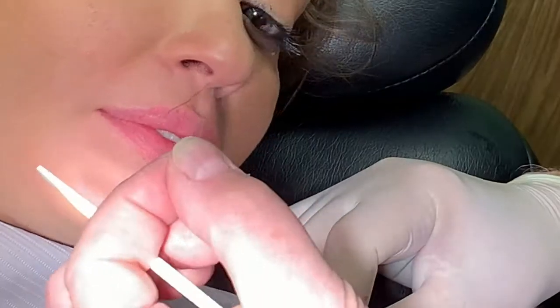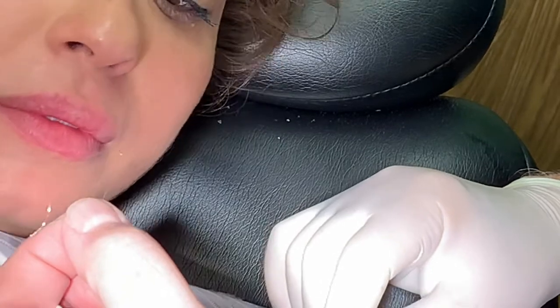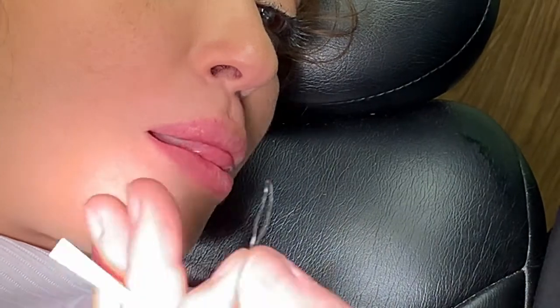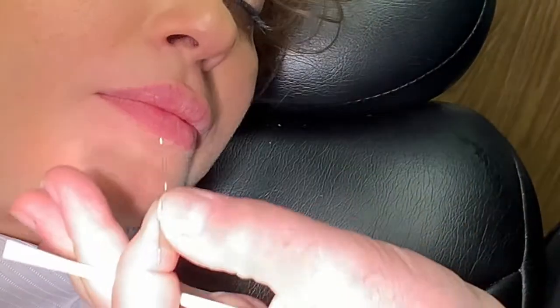That's it. It begins with this little piece of wire, and you have about 20 of them in your kit, okay? All right, here we go. Keep watching. The first thing that happens is you need to establish the distance, the comfortable distance that makes you feel happy and lets your jaw open and close.